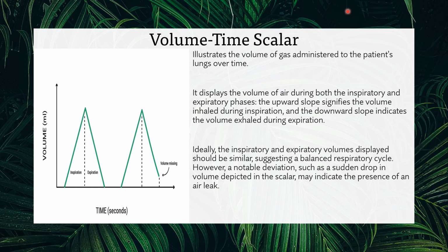Ideally, the inspiratory and expiratory volume displayed should be similar, suggesting a balanced respiratory cycle. However, a notable deviation, as you can see here, such as a sudden drop in volume, may indicate the presence of an air leak.